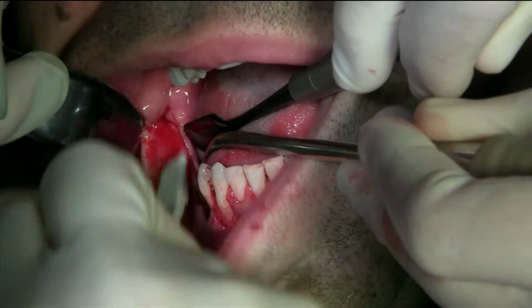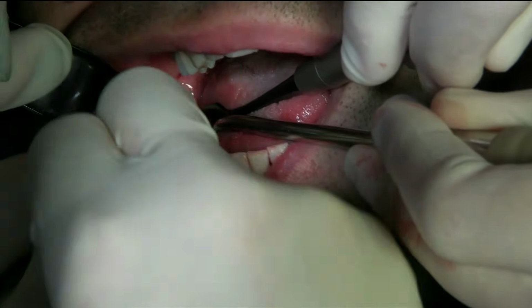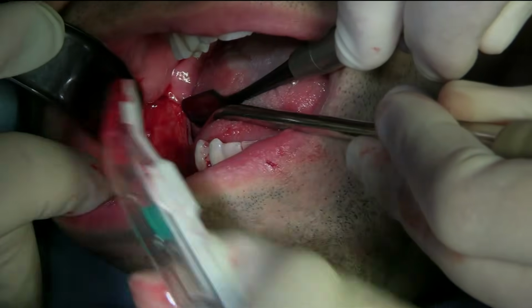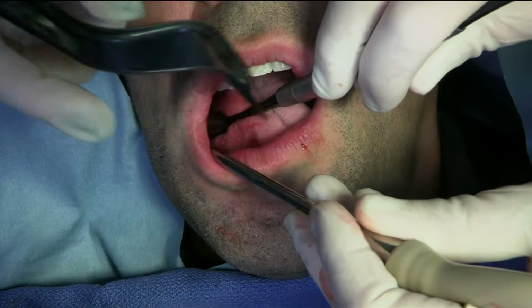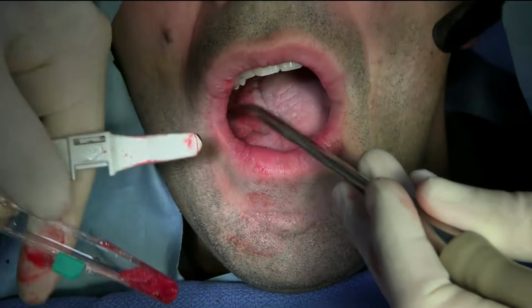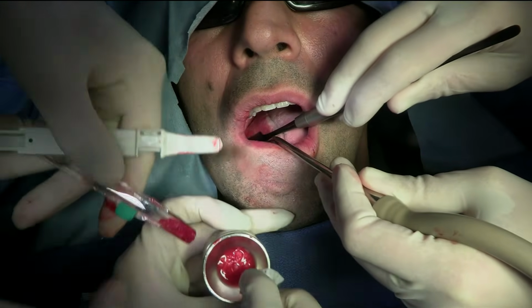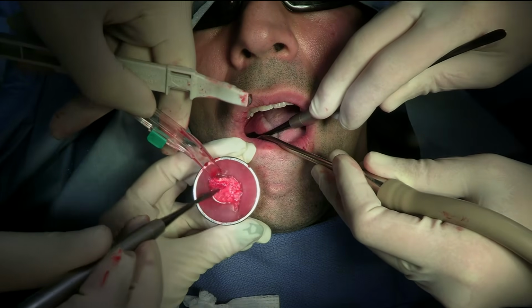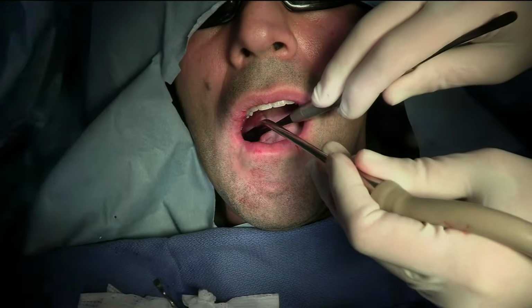Okay, so you can see the amount. Okay, let's put this in the wrapping dish. It's too much water. Okay, put it in the camera. Okay, good. So you can see that's a really nice amount. Okay, we can go back again.